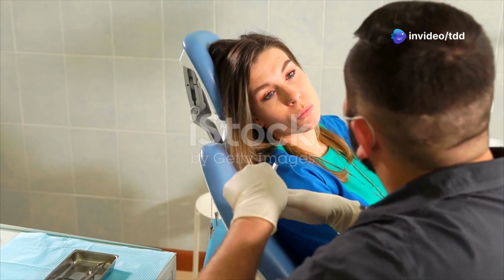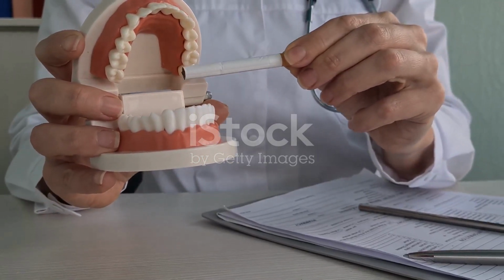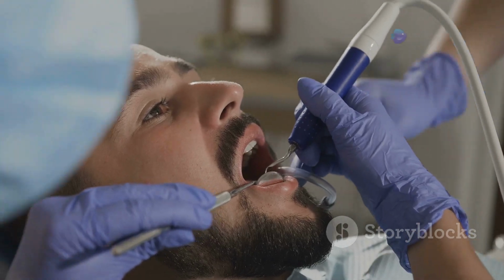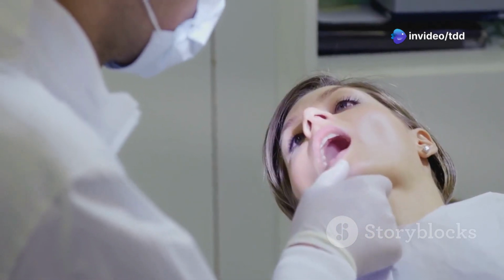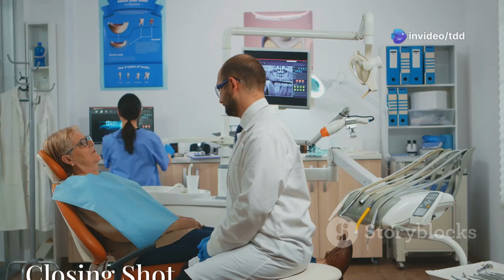Here are some quick tips for working on the mandible. 1. Always palpate landmarks like the coronoid notch and mental foramen. 2. Use aspiration to avoid injecting into blood vessels. 3. Be patient and inject slowly for better diffusion and less discomfort.